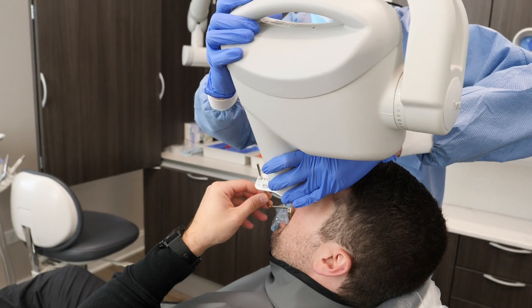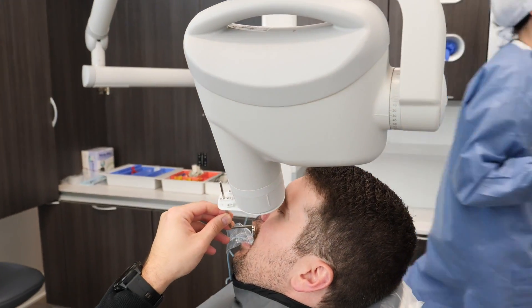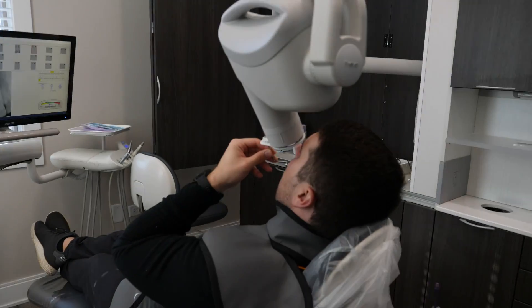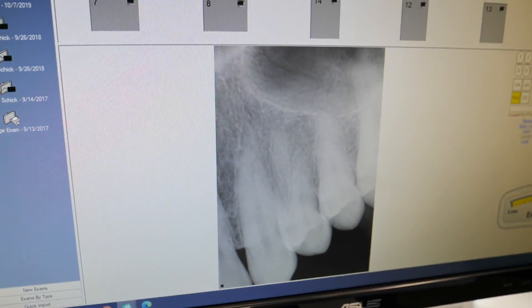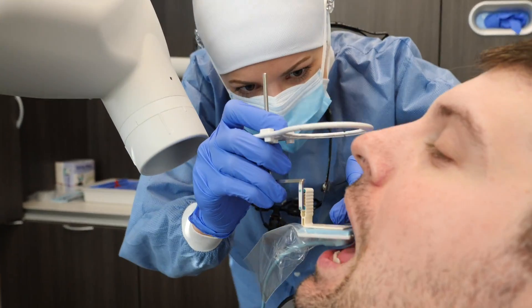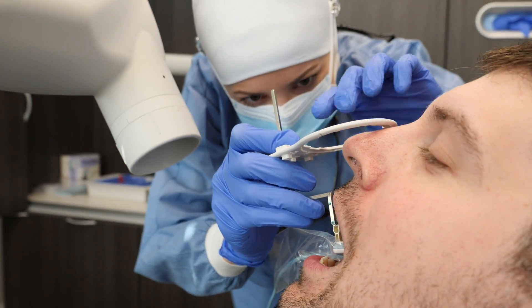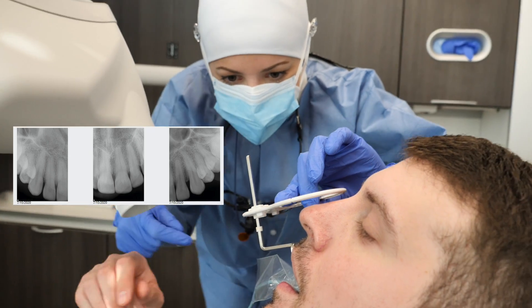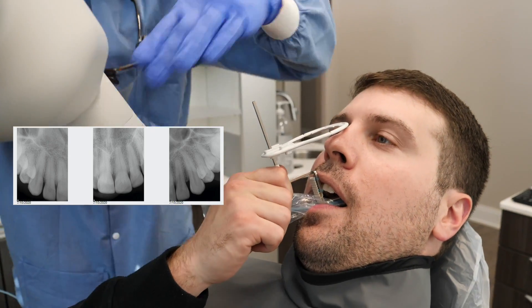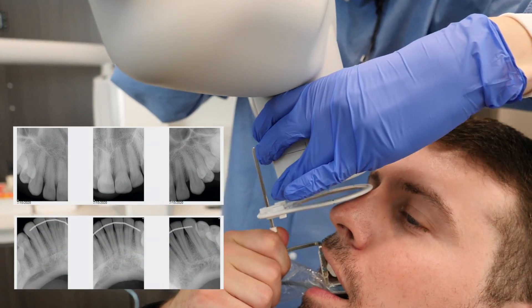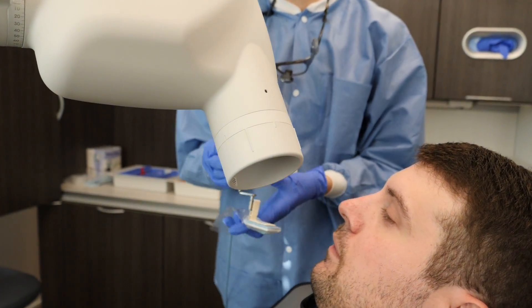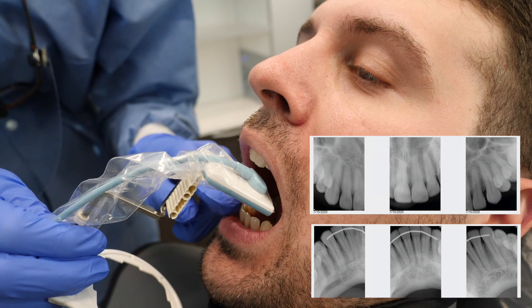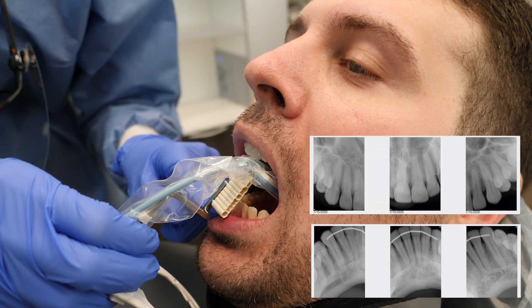Every clinician may take a full mouth series of images in their preferred order. There is no right or wrong way to take these, but what I tend to do is take all the front teeth first, also known as the anterior teeth, which as you can see I've already started. There are three images on the top for the upper front teeth and three on the bottom, so six anterior images in total, from canine to canine.